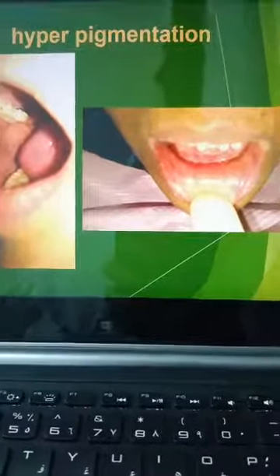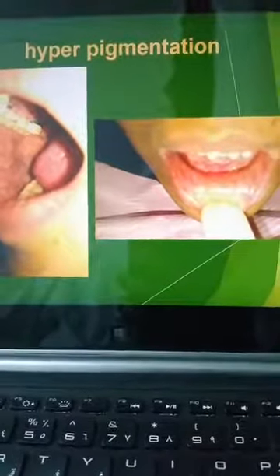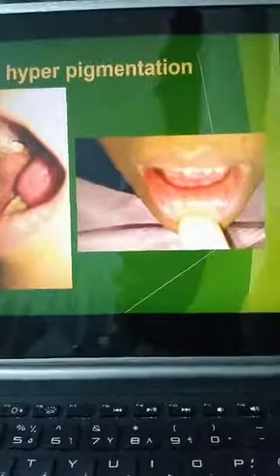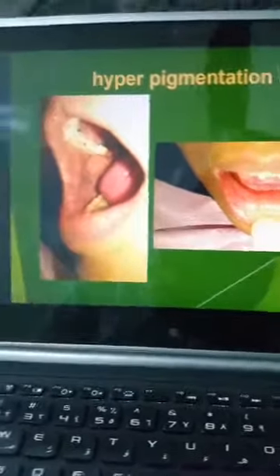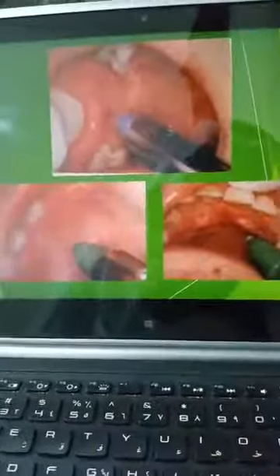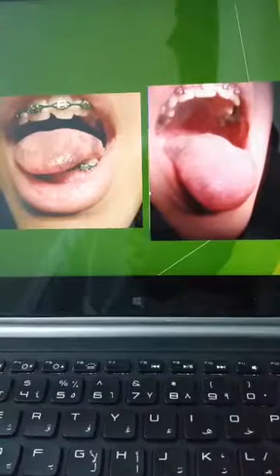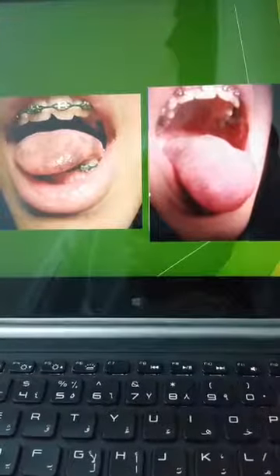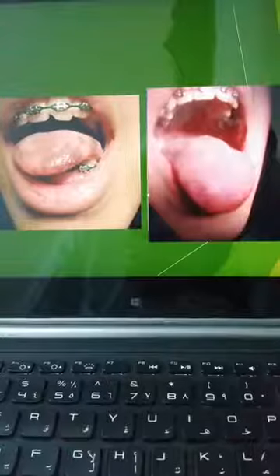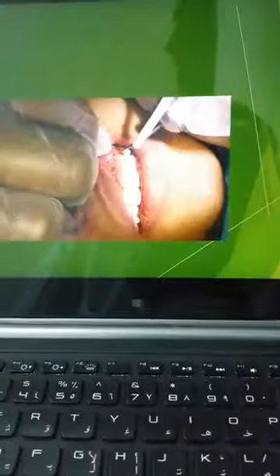In soft tissue depigmentation, you could use any type of laser, but of course, if you use the diode, it might go deeper and give you a better result. Although you can use the CO2, you can use the Er:YAG laser because there's not too much bleeding. You could use the laser without anesthesia, even in soft tissue depigmentation. Diode or Nd:YAG are very good tools for treatment of such cases in the gingiva.